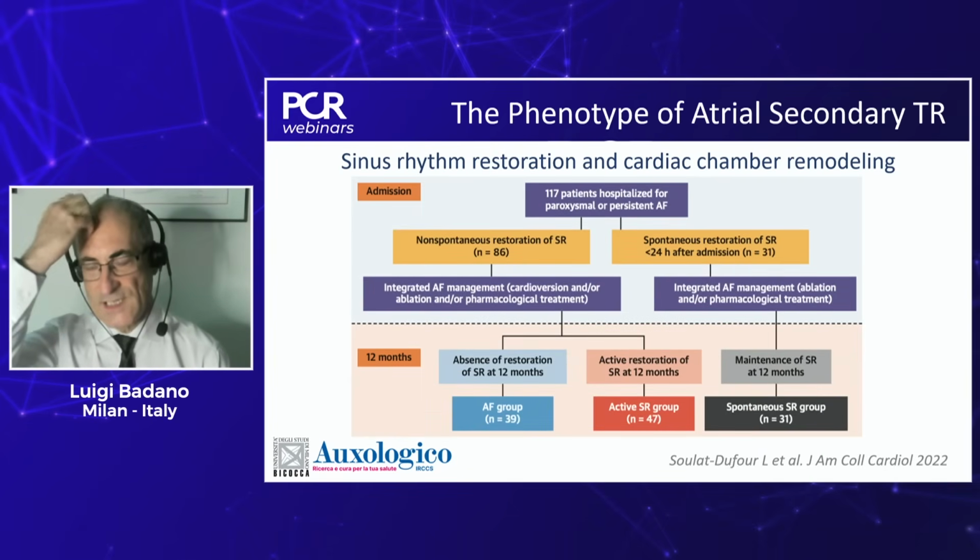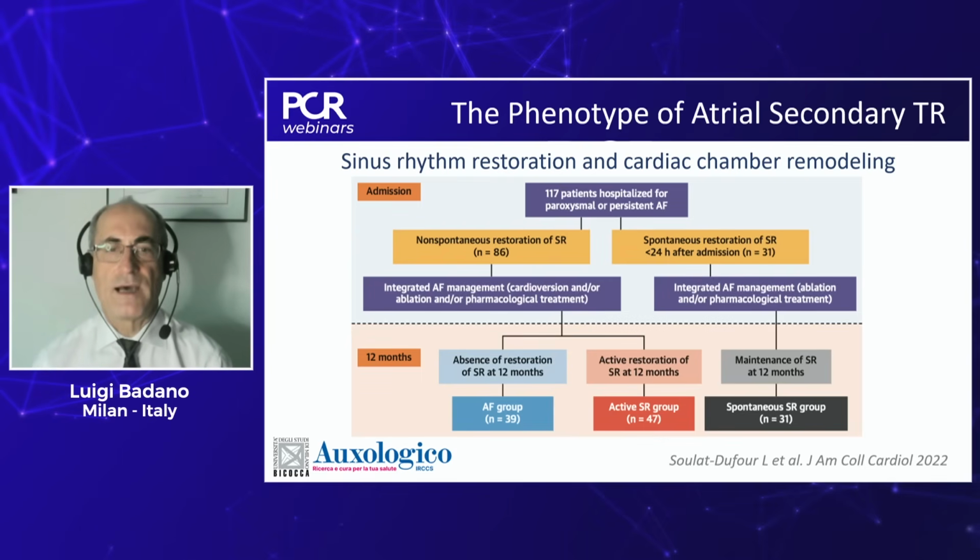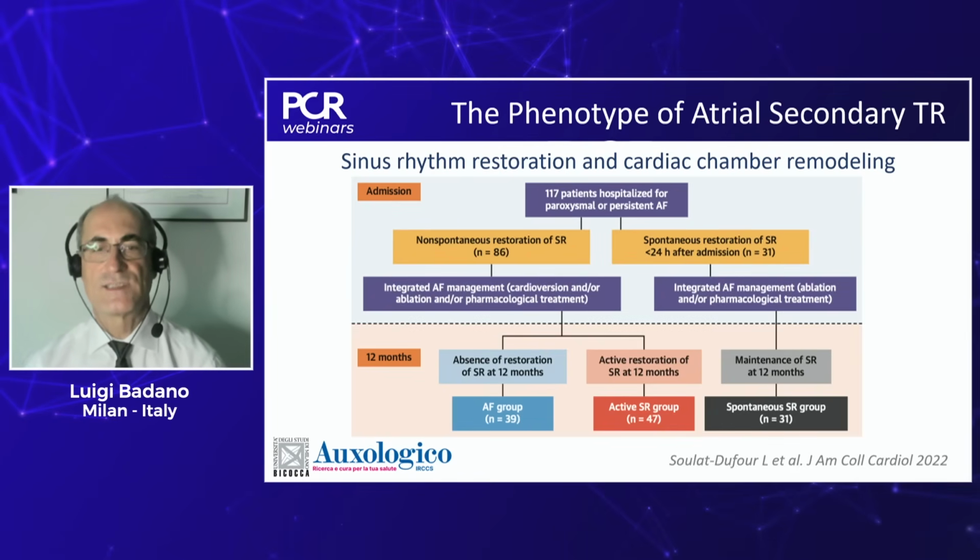This is a single clinical case, but very recently, Sulat, Dufour, and co-workers published in JACC the remodeling of the cardiac chambers in patients restoring the sinus rhythm.